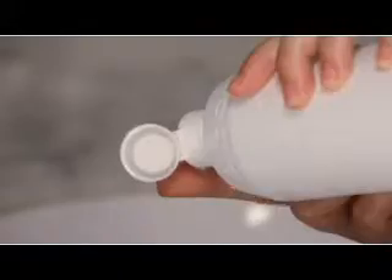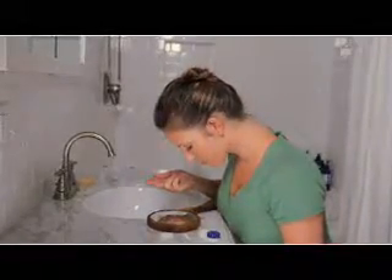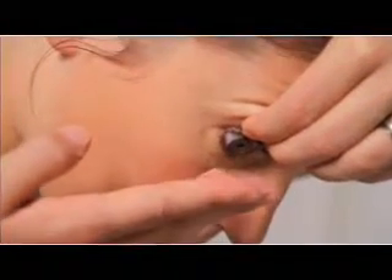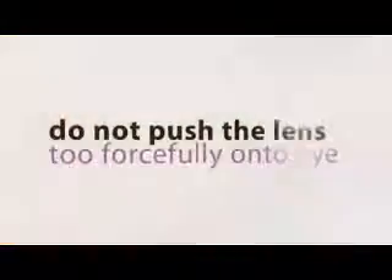The first step when inserting your hybrid lens is to fill the bowl of the lens completely to the top with solution before you insert it. Next, lean forward and tuck your chin to your chest — your nose should be pointed toward the floor. Look straight down into the mirror on your counter. With the left hand, reach over and pull up on the upper lid by placing the fingers at the base of the lashes. Pull down on the lower lid of the right eye with the right ring finger and gently insert the lens. It's very important not to push the lens too forcefully onto the eye. Gently let the lens settle onto the surface of the eye.